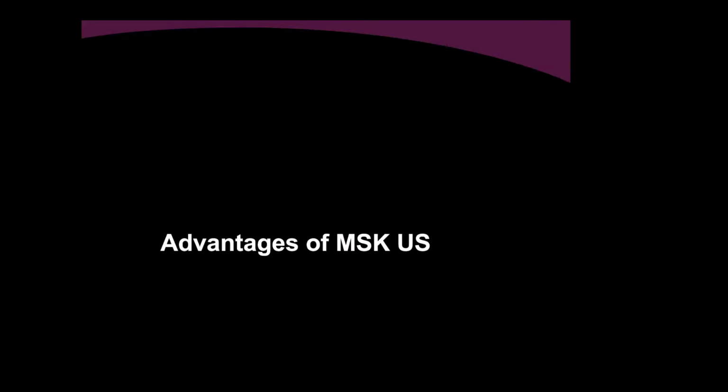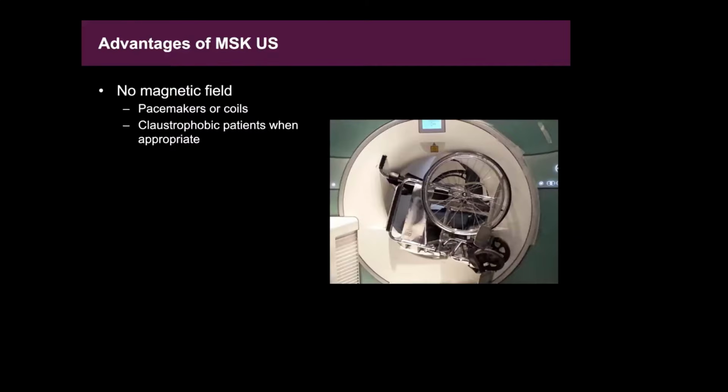So what are some of the advantages of MSK ultrasound? Why even bother? Well, one of the big advantages is that it doesn't have any magnetic field like an MRI. Every once in a while, we hear about a catastrophic accident where something metallic is taken into the MRI, causing injury to the patient. And some patients are just really claustrophobic and can't handle an MRI. So if you have a patient who fits those categories, MSK ultrasound may be a good consideration. Patients who have pacemakers and coils that may not be MRI compatible would also be good candidates for MSK ultrasound.